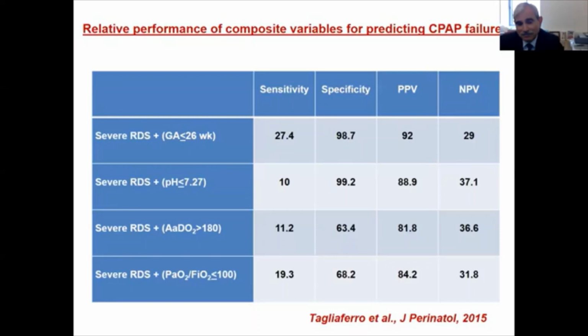Dr. Jayashila, neonatologist. I just want to ask you one thing. Have you ever used nasal masks? Like all your slides, you were discussing nasal prongs. So in Colombia, do you at all use nasal masks?